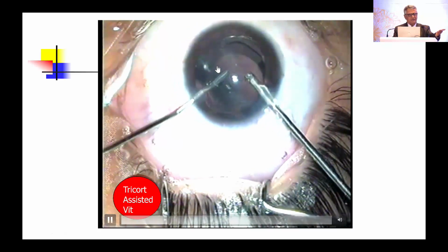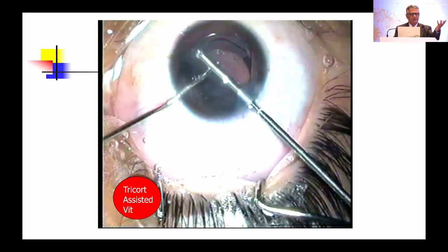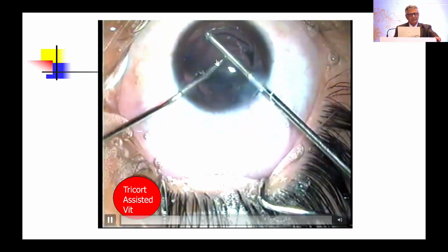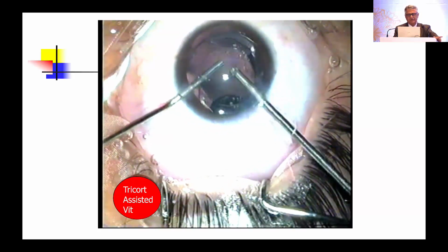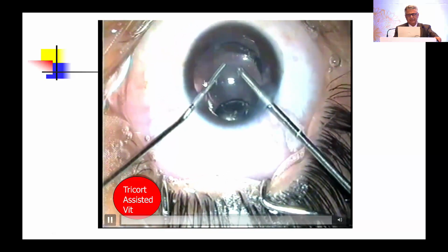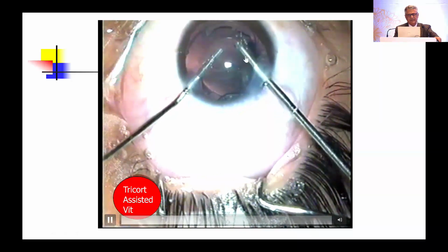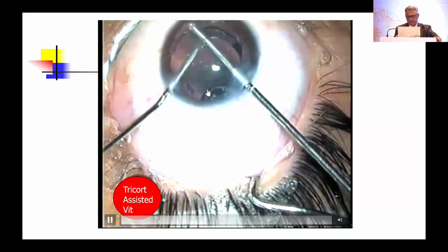Like he said, severed, because the connection between the anterior and the posterior should get severed, so that there should be no traction onto the anterior base. So this patient is less prone to posterior segment complications as compared to the first video which I had shown. So the IOL is already inside, but that vitreous, I think whatever was there in the anterior segment has been taken care of. Is this enough?